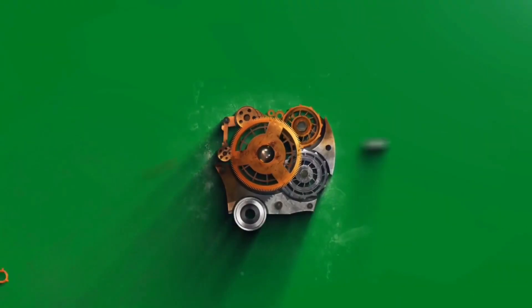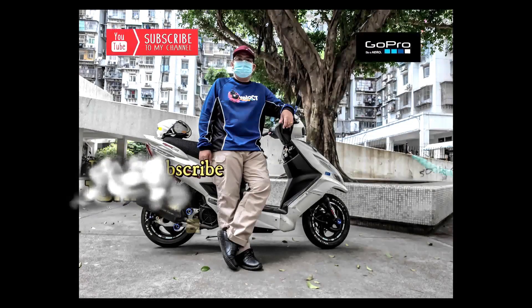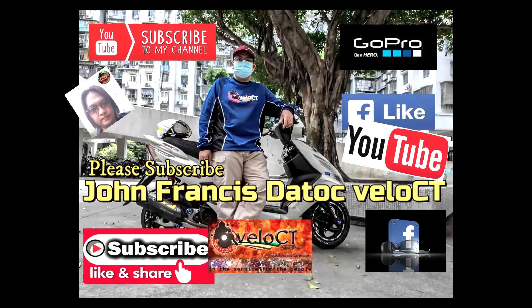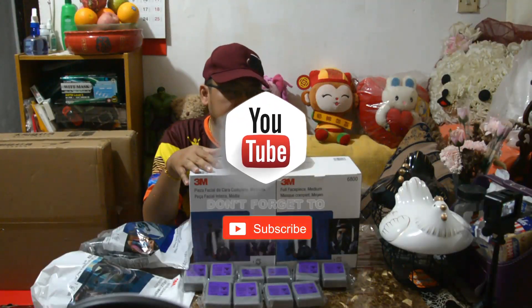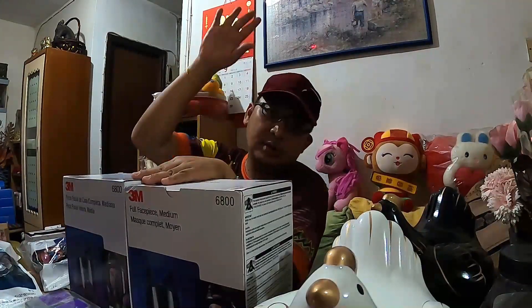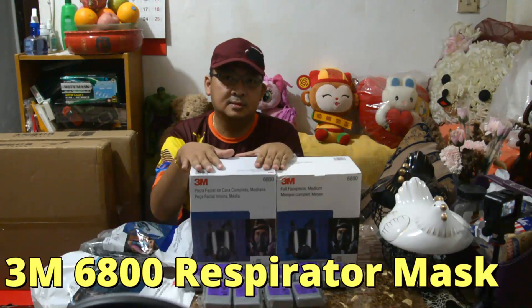This video is brought to you by B.A.R.I.N. Hello guys, good afternoon, ako ulit si John Francis Datok Velocity. Samaan niyo ako, ipakita ko sa inyo yung 3M 6800 full face silicon mask.